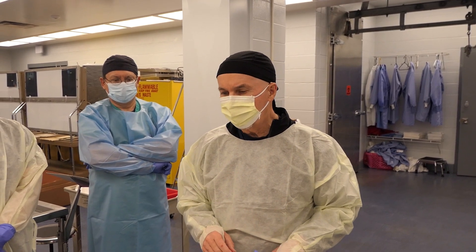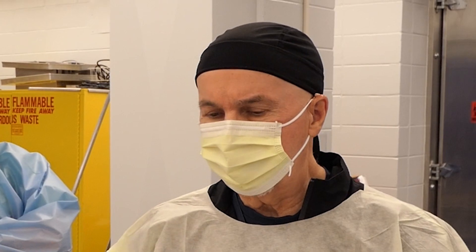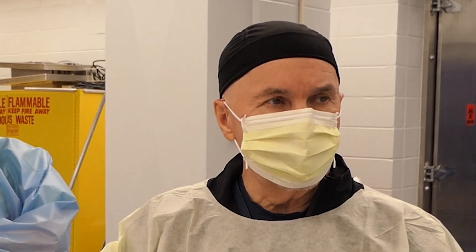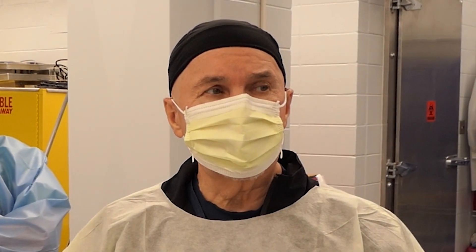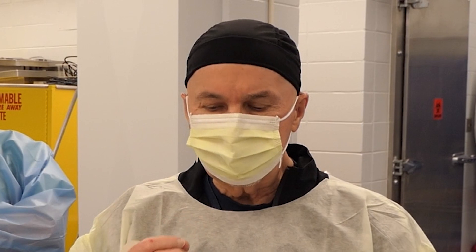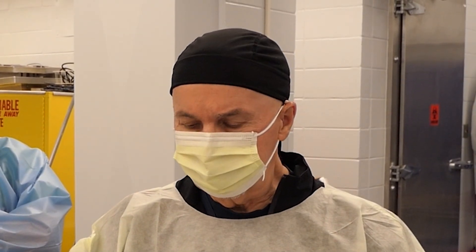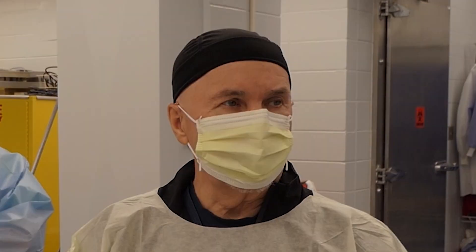This is a trick of the trade that is lost, but it's extremely valuable. There are actually some times and places where you need this — you're in an austere setting where you cannot get the patient's mouth relaxed. He's basically clenching his teeth, and that's the only way you're going to intubate.